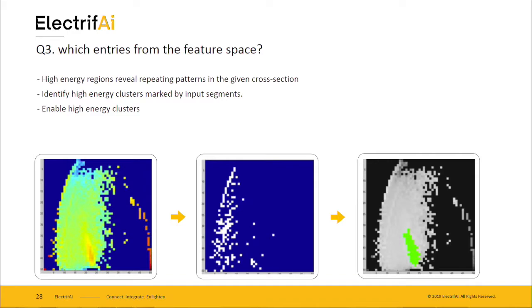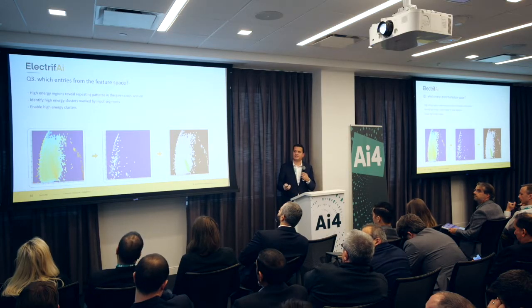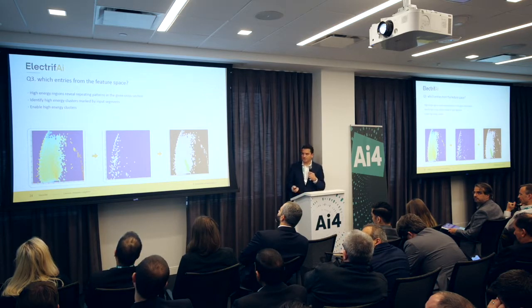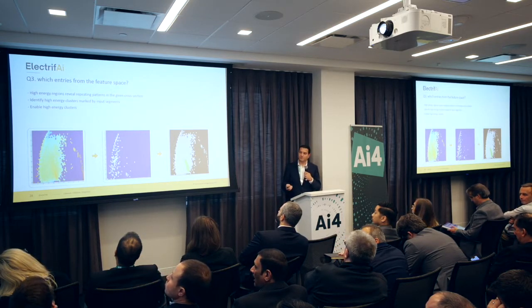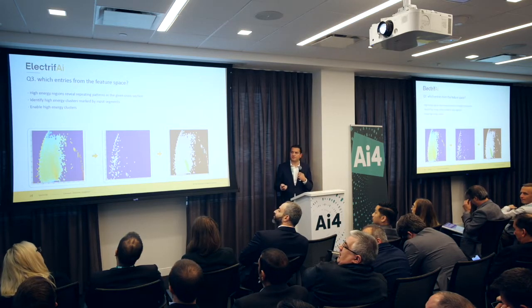But instead of having the image and pointing to a specific area, in this specific example we have the attribute space, and we're saying that it's these attributes and these values that correspond to the objects of interest. So we get something like that, because next to our core objects within our regions of interest, we also have the surrounding neighbors, which can be individual pixels.